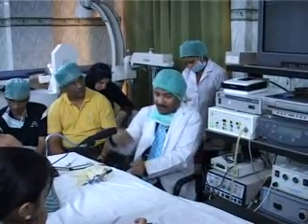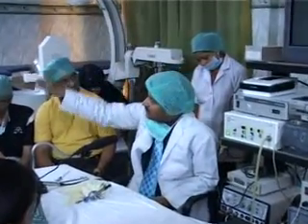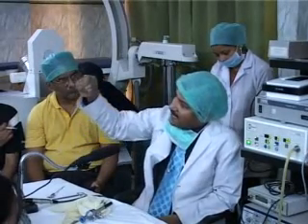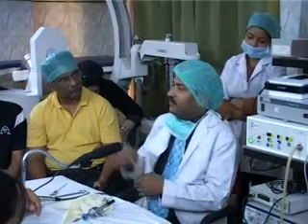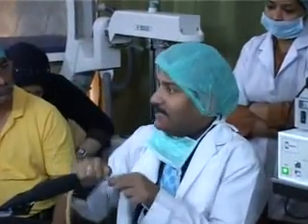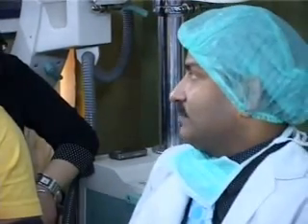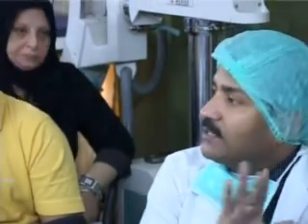Just like an IV drip, when you are putting it, your nurse should take all the air out of the IV channel. Once the air is out and at the tip there is only saline, then it should be connected. In exactly the same way, we have air inside, and without flushing that air out, if you directly connect it and then switch it on, air will go in, and that air is dangerous. So we should take care, and in the insufflator this precaution is also given so that the machine will take care of itself.